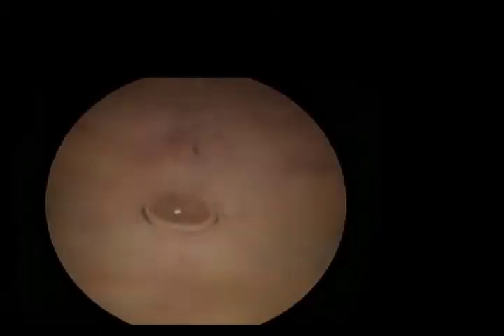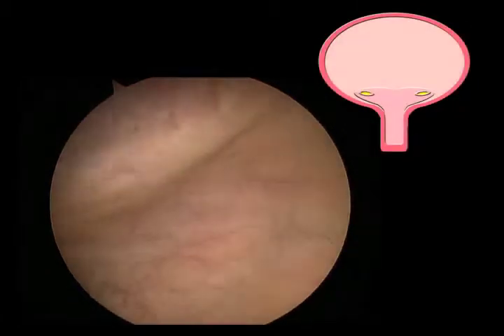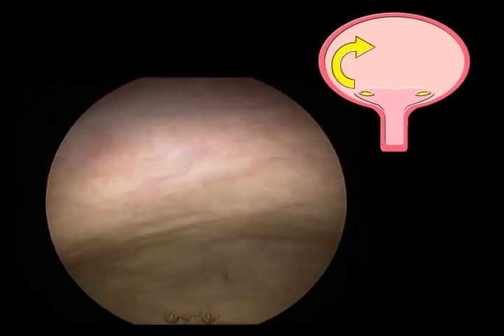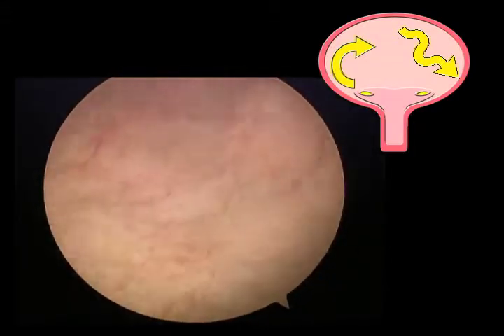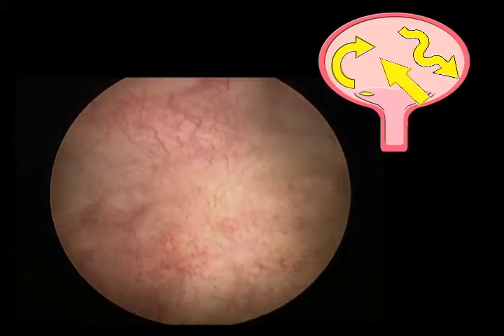Examination of the bladder. Diagnostic cystoscopy is often performed by physicians to evaluate the bladder. However, it is not always performed in a manner that is consistent and reproducible from patient to patient. A methodical approach to examination of the bladder should be performed each time the cystoscopy is done to avoid an irregular or erratic pattern of examination of the bladder.